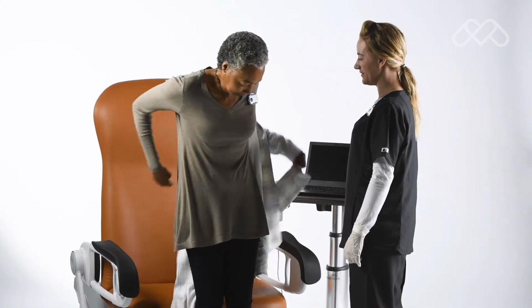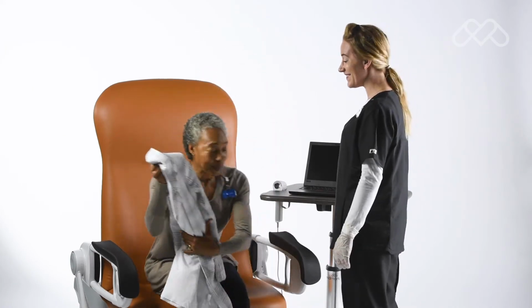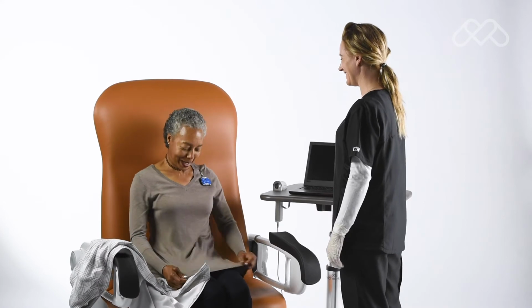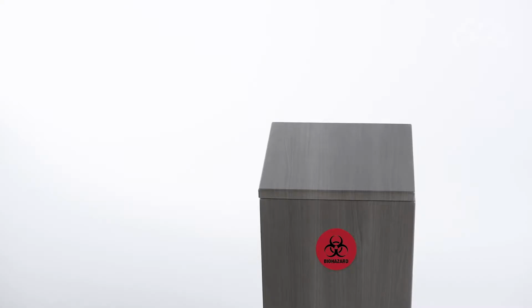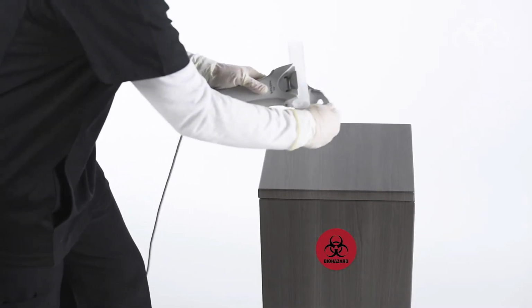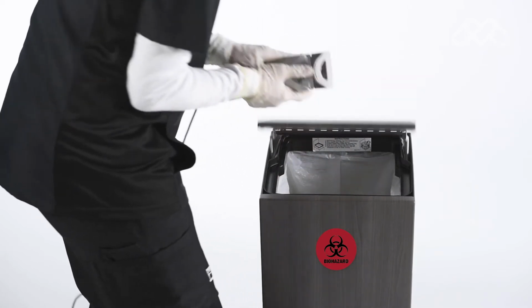Ask the patient to loosen any restrictive clothing. If the patient has dentures, have them place them in a cup during testing. Use of a nose clip is highly recommended during the testing procedure. Avoid cross-contamination by disposing of each disposable mouthpiece and replacing it with a new one for each patient.